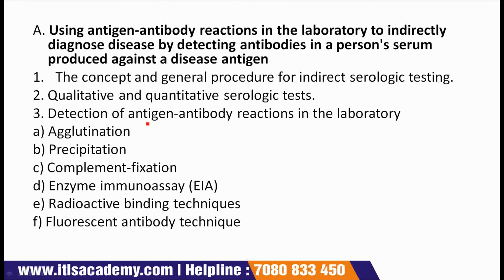First one is using antigen antibody reaction in the laboratory to indirectly diagnose disease by detecting antibodies in a person's serum produced against a disease antigen.